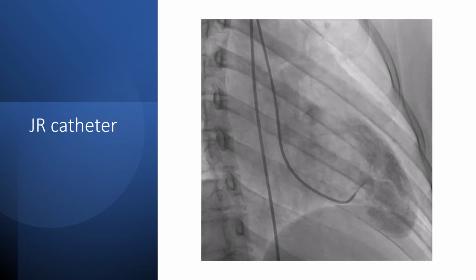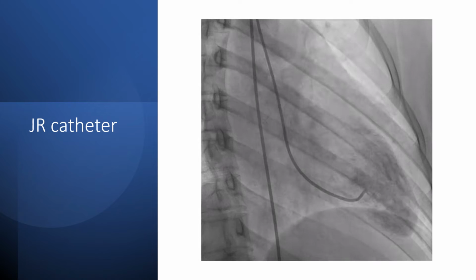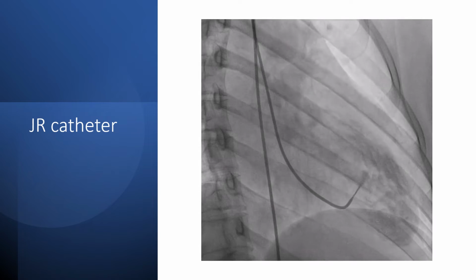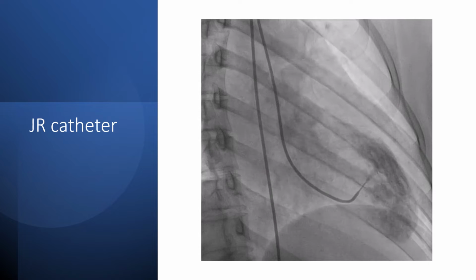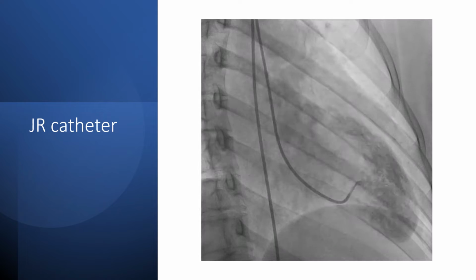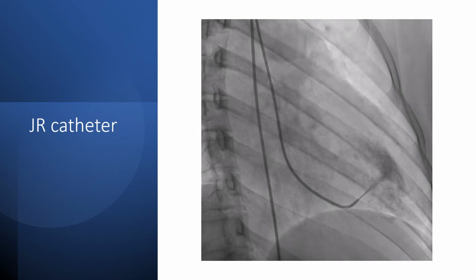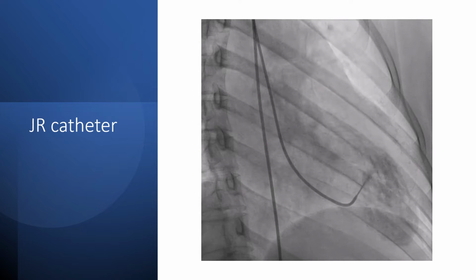Some operators exploit the coronary catheter to do LV angiography and make some measurements, especially the Judkins right catheter, when it inadvertently passes into the LV during an attempt to engage the RCA. This should be done carefully and is generally not advisable, as the information it gives might not be complete. And also there is a risk of myocardial staining and even perforation if power injection is used.